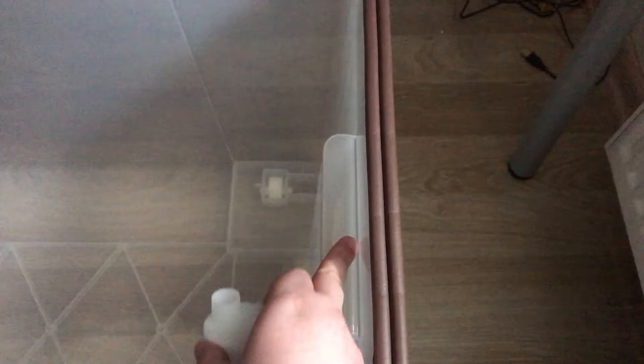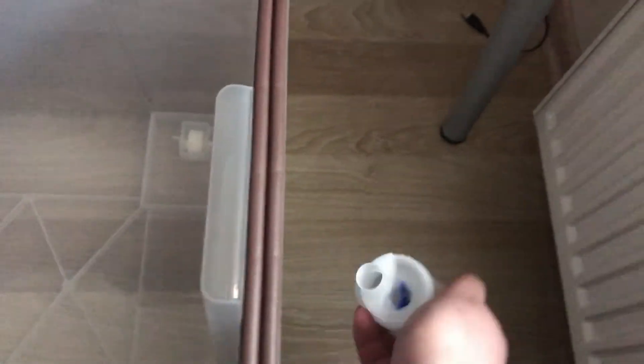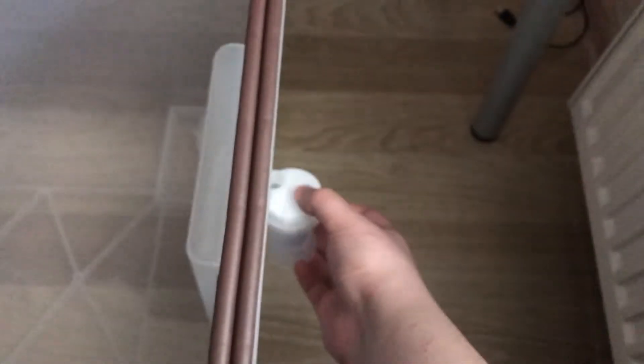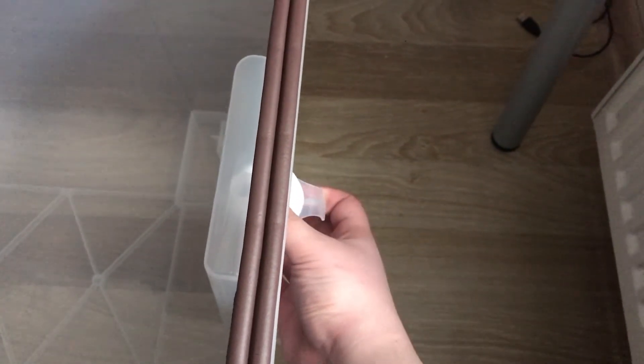Okay, slight change of plan. I have noticed that this thing fits through here, so all I have to do in theory is just drill a hole here, put this thing through, and maybe use some duct tape or something to seal it. That basically seems to be the solution, and I'd obviously also have to secure this white cap part of this.